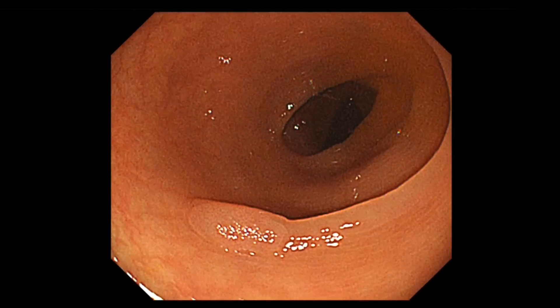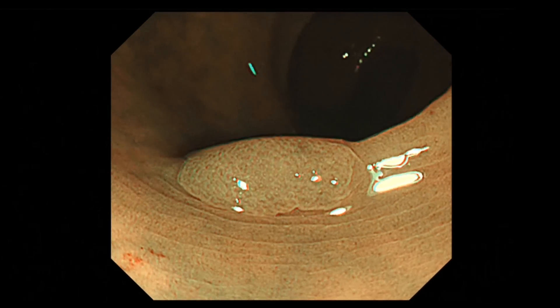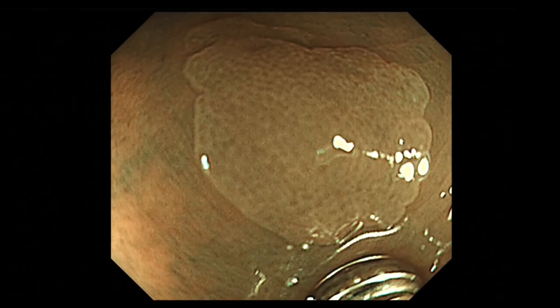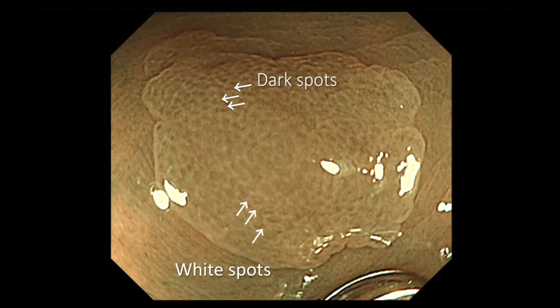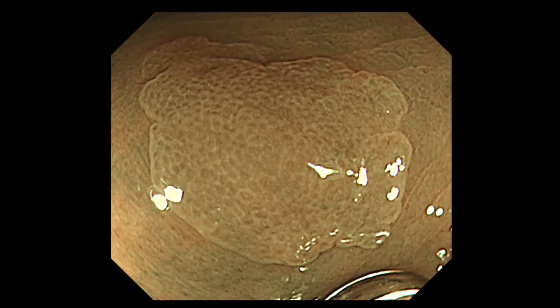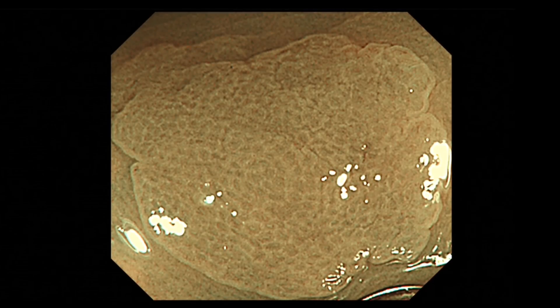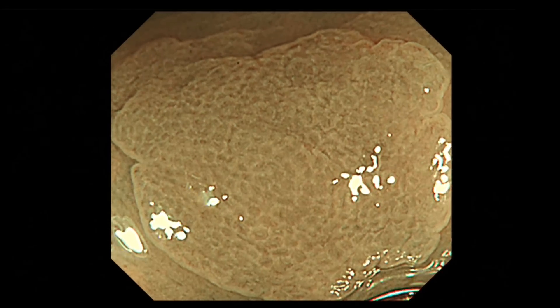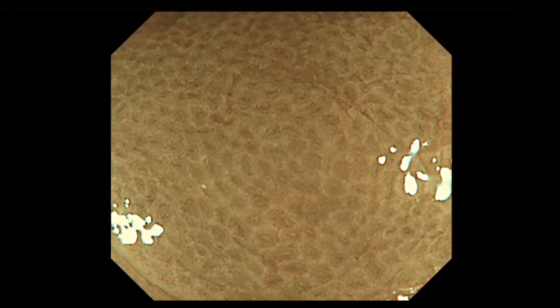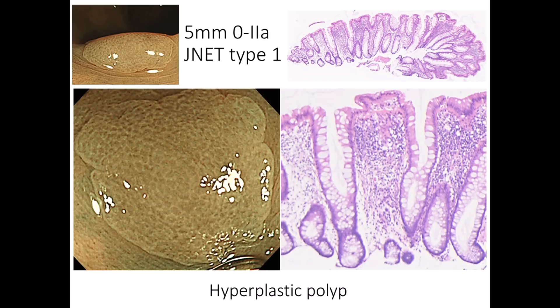Here we have a slightly elevated polyp 5 mm in diameter. We cannot see any vessel structures on this polyp. Both regular white spots and dark spots are observable, and the surface structure has no specific features — the pattern is similar to the surrounding normal mucosa. Therefore, this lesion is classified as J-Net Type 1. This polyp was resected by snare polypectomy. The histopathological images show serrated glands without any dysplastic change, so it is diagnosed as hyperplastic polyp.